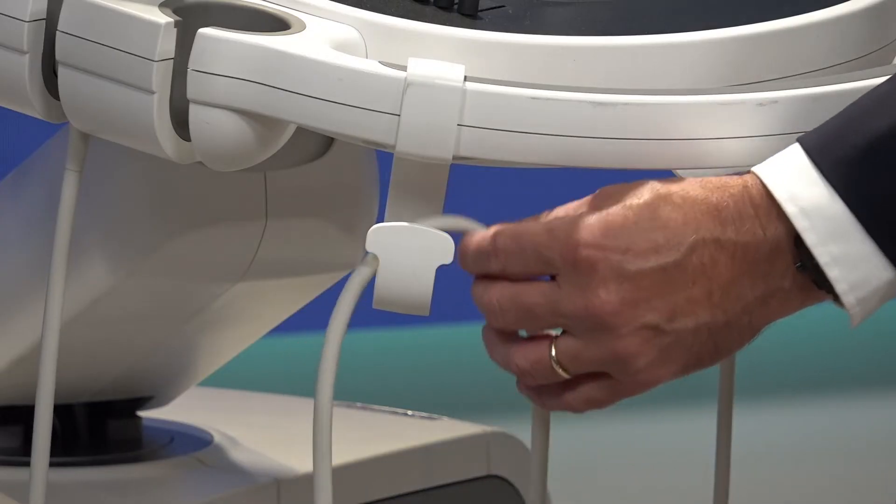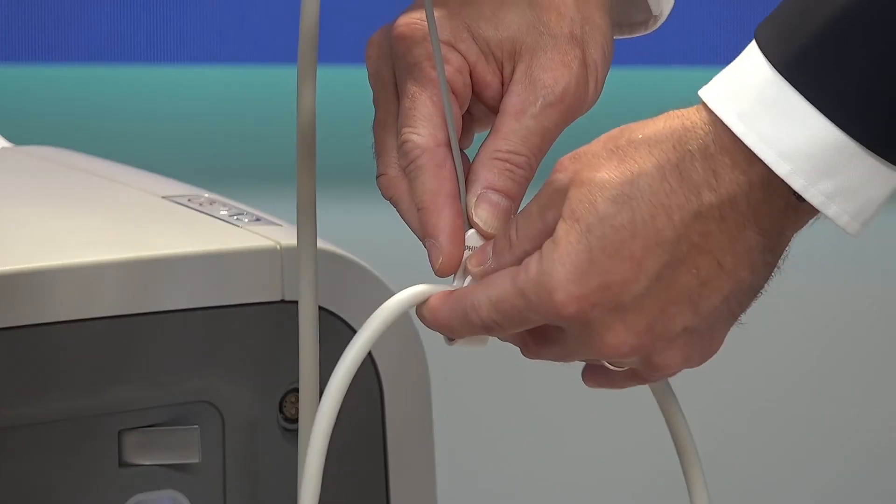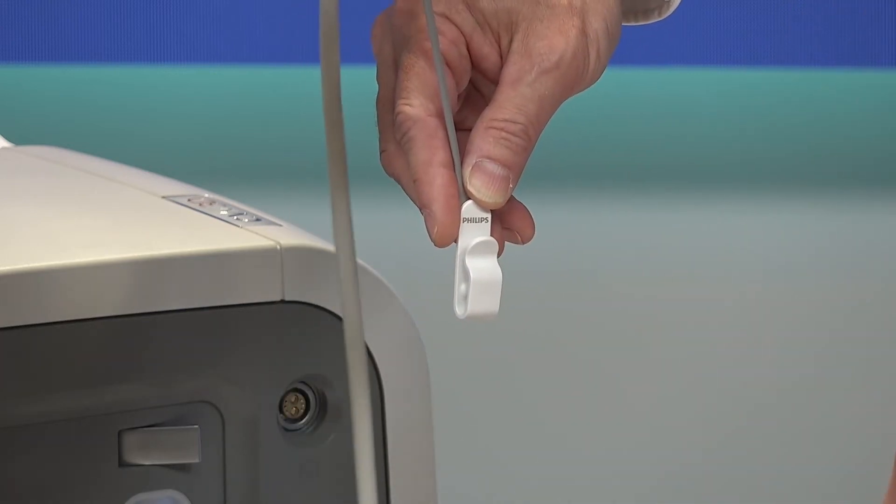If you want or need to clean the cable, make sure to lift the cable from the cable support or detach the cable from the EasyClip cable management before cleaning the cable with a soft cloth.